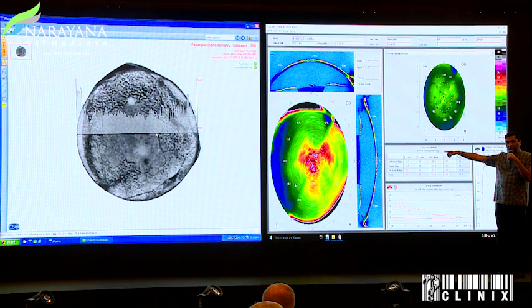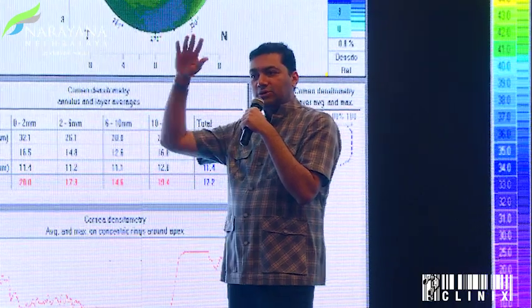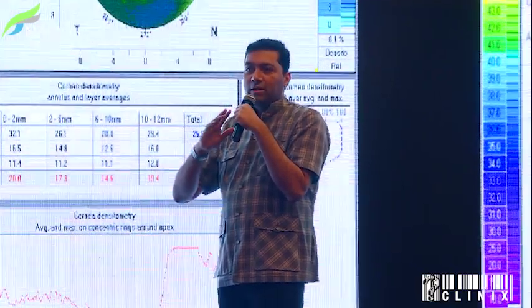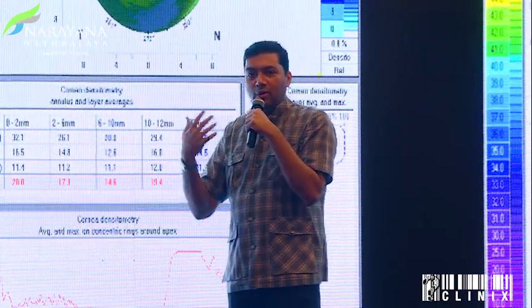I mean, if you do this with ultrasound, you see some thickening after cross-linking, not thinning. If you do it with a high-resolution OCT, the thickness of the cornea after 3 months is exactly preoperative. So that thing that we published in 2006 or 7, that the cornea gets thinner after cross-linking and then returns to normal after 1 year, is a classical optical artifact due to the densitometry. We published this work that when you have a thicker densitometry, your cornea just drops down very thin. The machine, for some reason, picks up Pachy as low as 100 microns, 200 microns. I've got this many times.